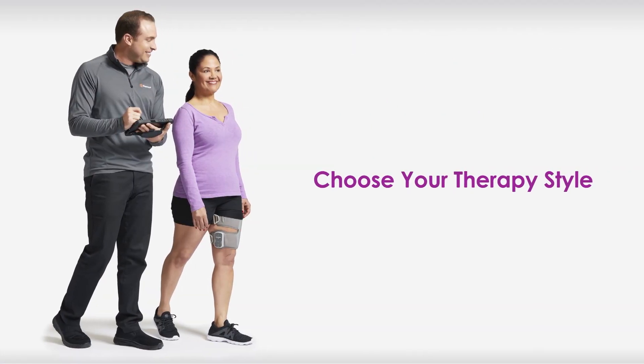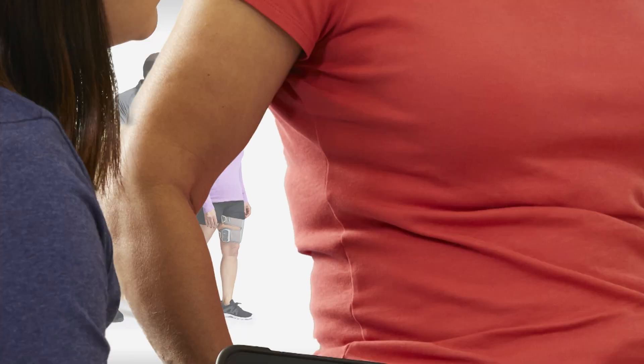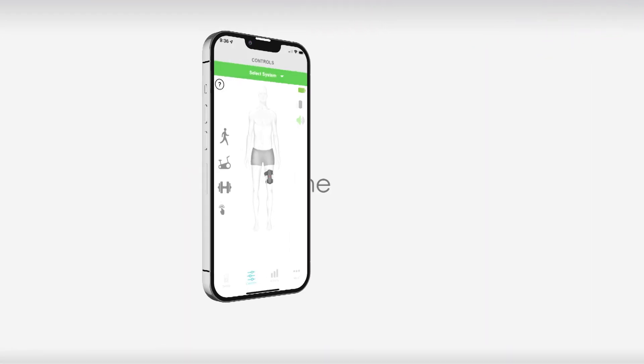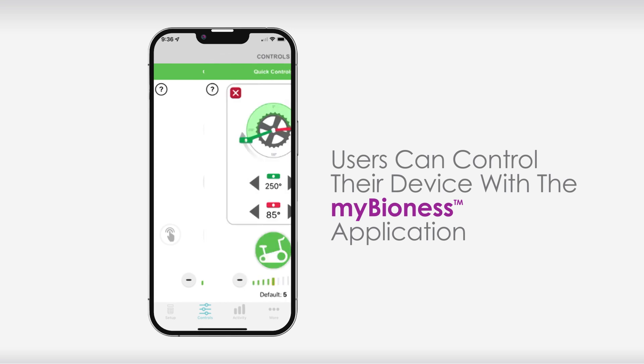Choose your therapy style with three distinct modes for any stage of recovery. Standardized assessments make it easy to objectively track and document patient progress. Plus, users can control their therapy and track their progress on their own using the MyBioness app.